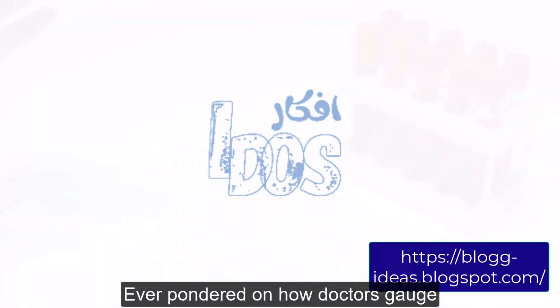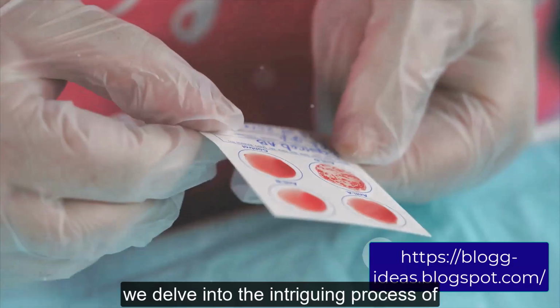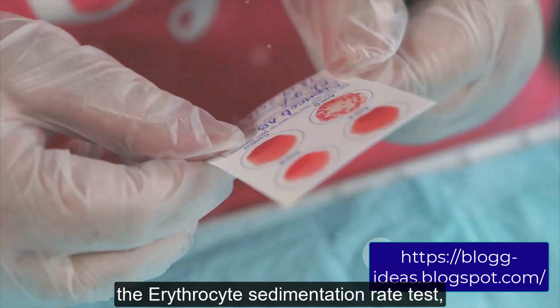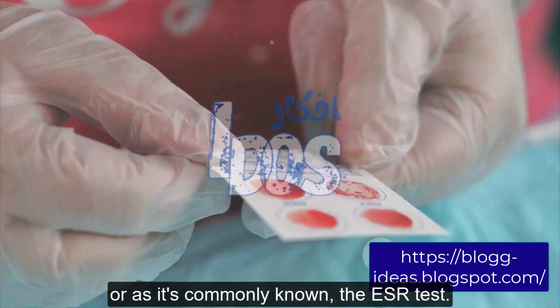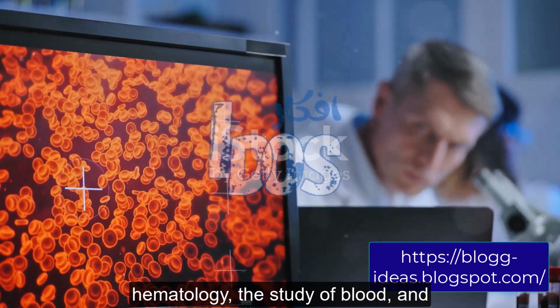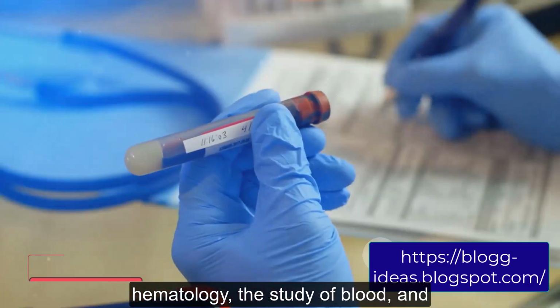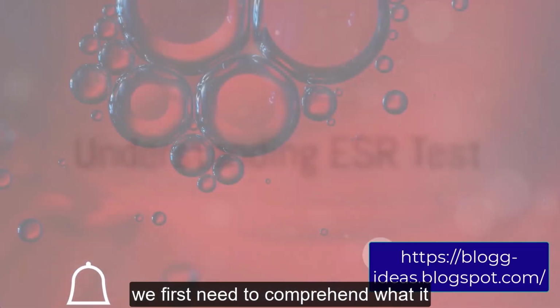Ever pondered on how doctors gauge inflammation in our bodies? Today, we delve into the intriguing process of the erythrocyte sedimentation rate test, or as it's commonly known, the ESR test. This test is a crucial component of hematology, the study of blood, and offers a non-specific measure of inflammation. To understand the ESR test, we first need to comprehend what it measures.